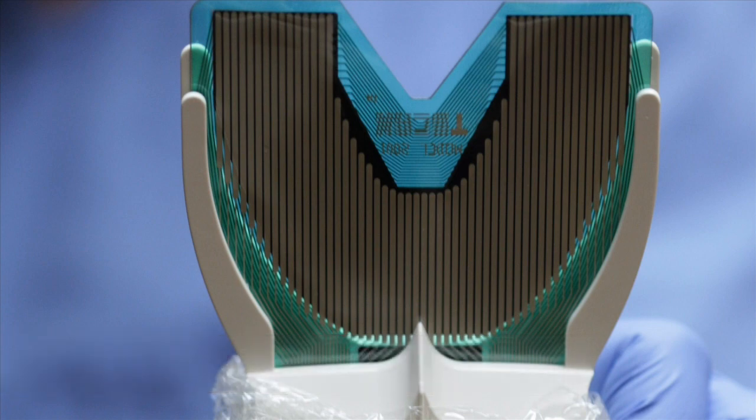Yes. And does the fact that it has a little bit of thickness to the sensor bother you in any way? If it were too thick, I think it would. The current thickness is not troublesome to me. Perhaps a more thin sensor would yield better information. Obviously, in discussing the thicknesses that do produce an alteration in muscular contractility, muscle contractility will begin somewhere between 20 microns and 100 microns. And the sensor itself is somewhere in the neighborhood of just under 100 microns thick. So it's within range of accuracy. If it were thinner, that probably would be better.